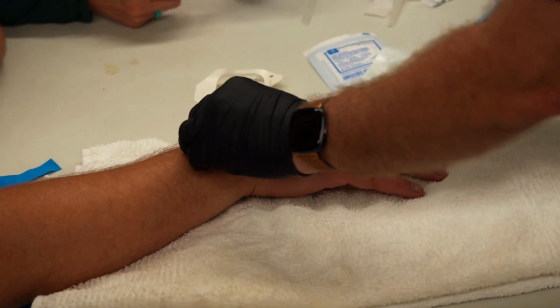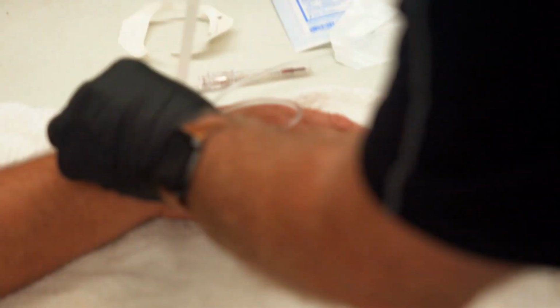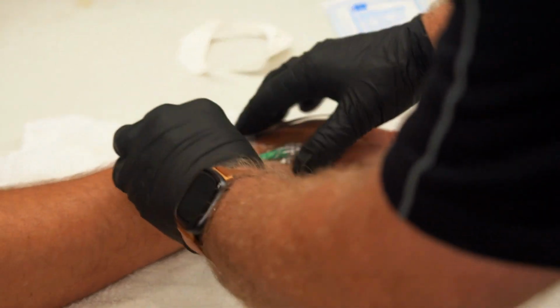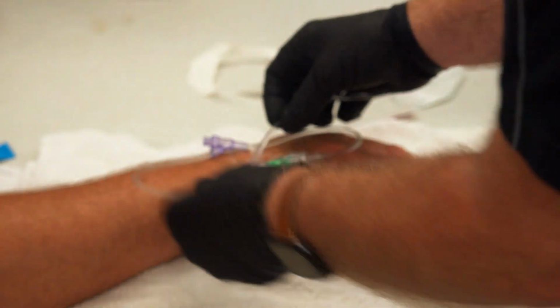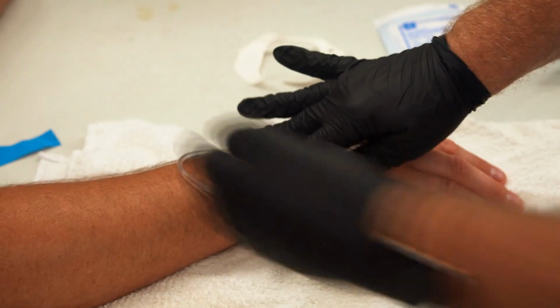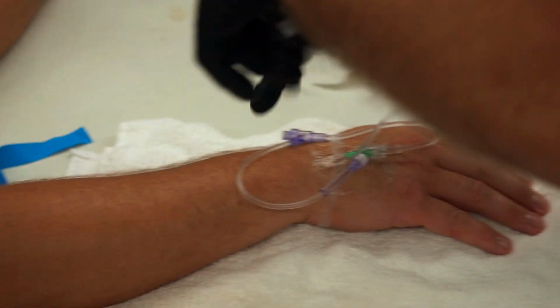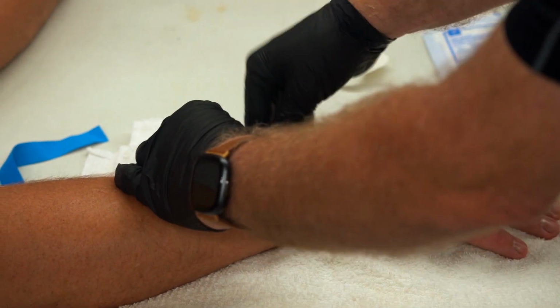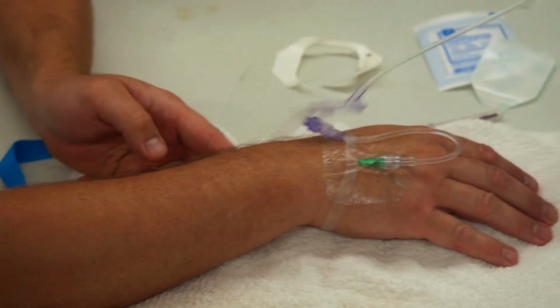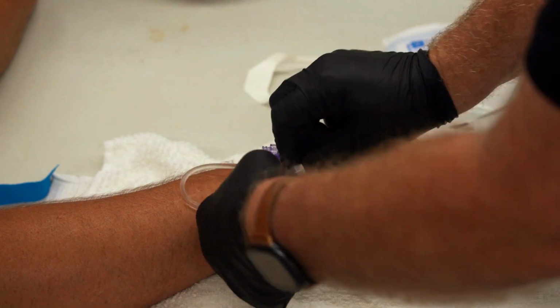And you tape it down because you don't wanna accidentally rip it out. So this is just holding that in there, but we're keeping the space around it so we can still see if it's swelling or bleeding or anything else. Then I usually do one across here. And then I usually do a second one upstream, or up there. So a couple of different ways you can do it, but this is my second one. I'll try and do 2 so that if we yank one, that's a safety, so this first one doesn't come off right away, so it becomes my second kind of a safety.